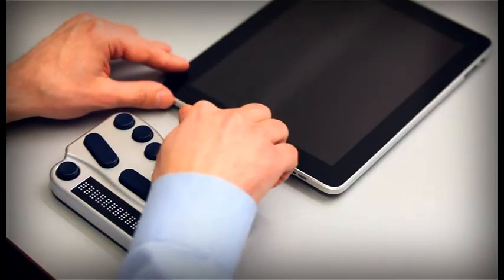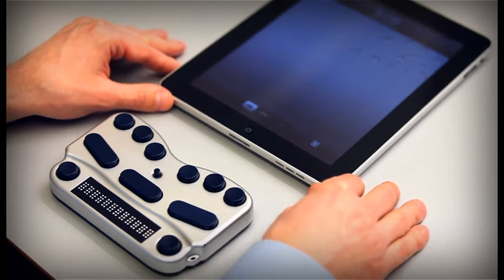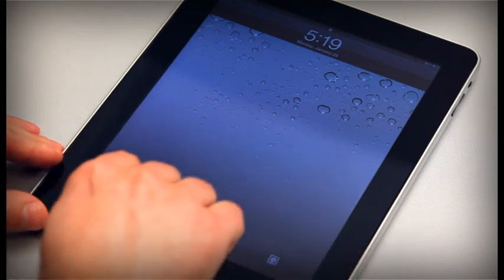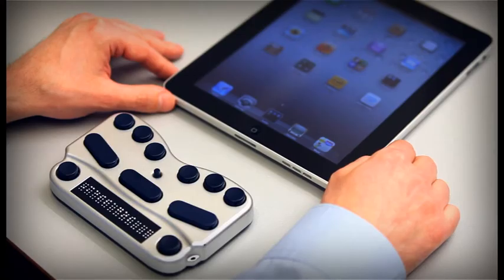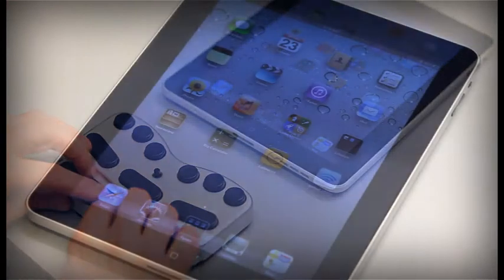Navigation works in the same way on an iPod, an iPad, and an iPhone. If your iDevice is asleep or locked, wake it up or unlock it. Press the Home button, swipe your finger across the display until you hear Slide to unlock, and then double tap. Slide to unlock. Slide or double tap. You will hear the BraillePen 12 beep as it reconnects.